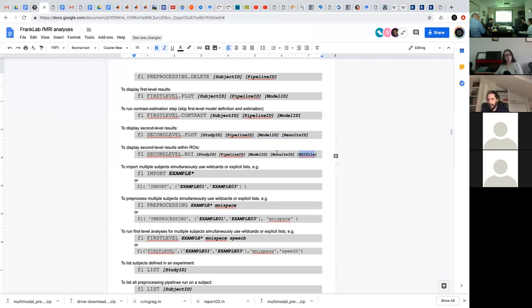Sorry, go ahead. If we use the FreeSurfer subcortical ROIs, those are all subject-specific. Those are subject-specific segmentations. Right, exactly. When we're doing these giant pooled analyses, we have gotten away from doing individual corrections. But when we do individual study analyses, we will often go in and edit some small number of ROIs on them.